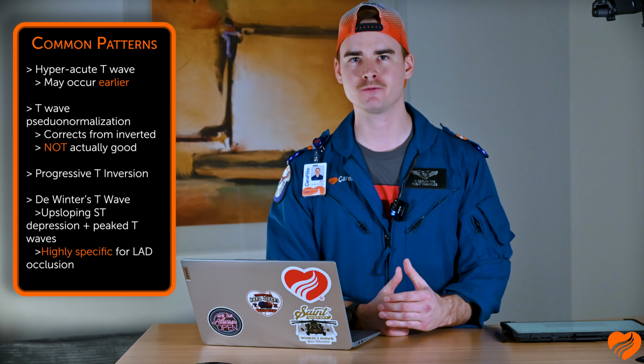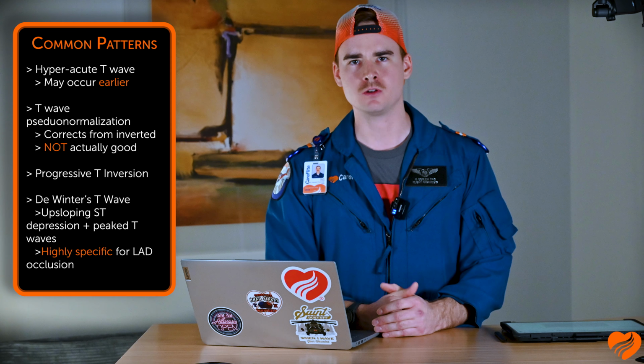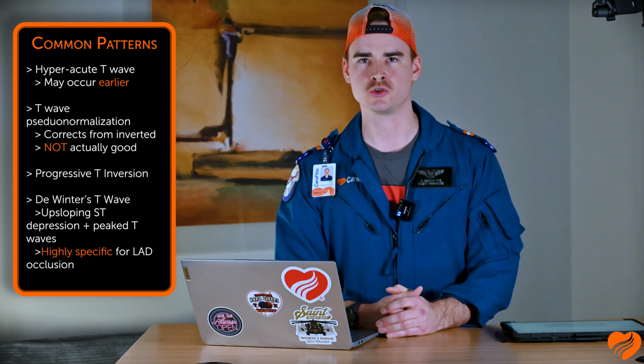Rolling into some common dynamic T-wave patterns to recognize, that will be your hyperacute T-wave. That's your very tall, very broad T-wave that generally doesn't match up with the QRS you're assessing it with. And these will generally occur earlier on in the cascade. Also, you may find T-wave pseudonormalization, again, taking those previously ischemic or inverted T-waves, and they will become upright as the injury evolves.